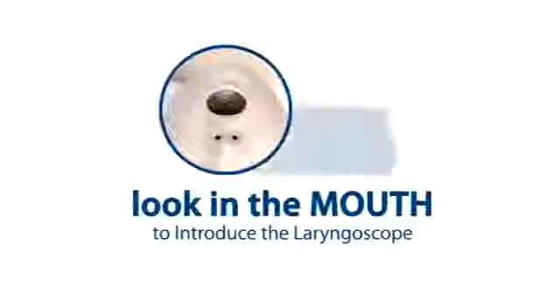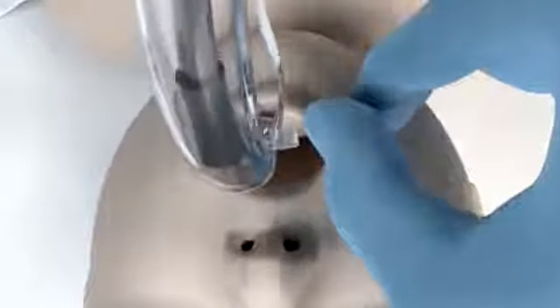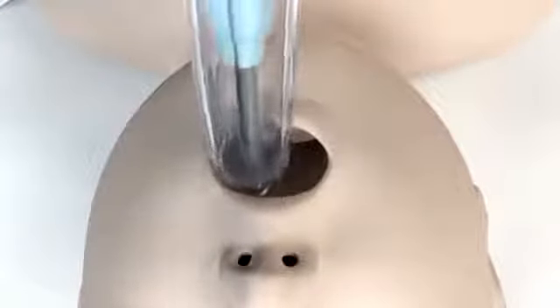Begin step 1 with direct vision, looking directly into the patient's mouth. With the patient appropriately positioned, scissor the mouth open and look inside to introduce the laryngoscope. With the GlideScope video laryngoscope in your left hand, introduce the GlideScope into the midline of the oral pharynx, avoiding any sweeping of the tongue.